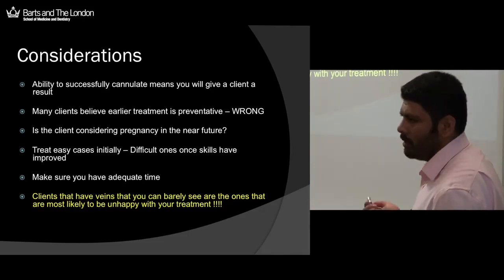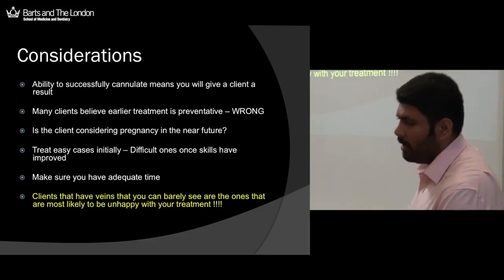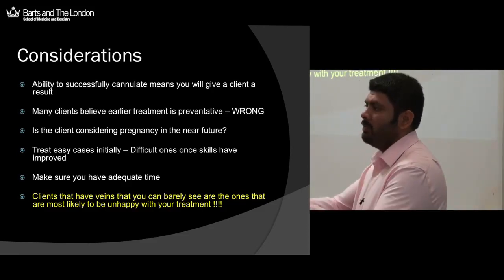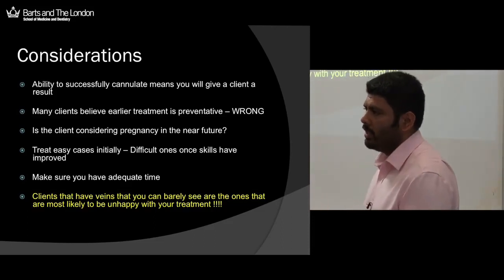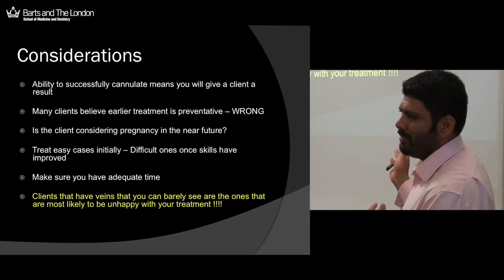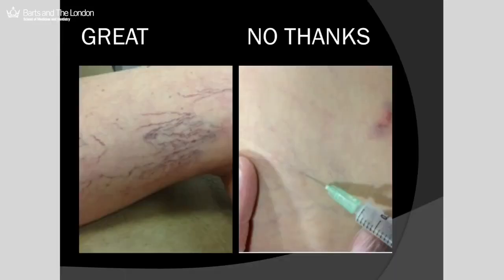barely see, because what's going to happen is they're going to get all the side effects of sclerotherapy, pigmentation problems, and they're going to get new, what we call telangiectatic mats, which is a process of neovascularization that occurs after insult to vessels. And they'll just come back and say, well, I didn't have very large vessels to start with, now everything just looks worse. This is what you want to be treating first. Things like this, where you're going to make a big difference. If you are trying to inject things that look like this, you're just asking for a world of trouble.